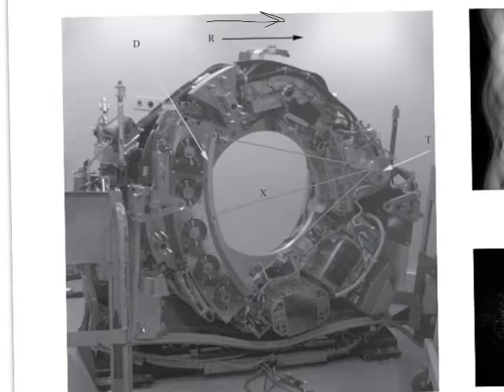If you ever get a chance, if they're ever doing diagnostics on the CT and they take the gantry cover off and do the spin test, watch it. It is amazing. There are YouTube videos, maybe we'll watch them in a little bit, of some of the newer CT scanners doing the spin test without the gantry. It looks like it could just pulverize you if you got too close, like it would suck you in and pulverize you. Very, very powerful. And this is literally what we're feeding our patients through.